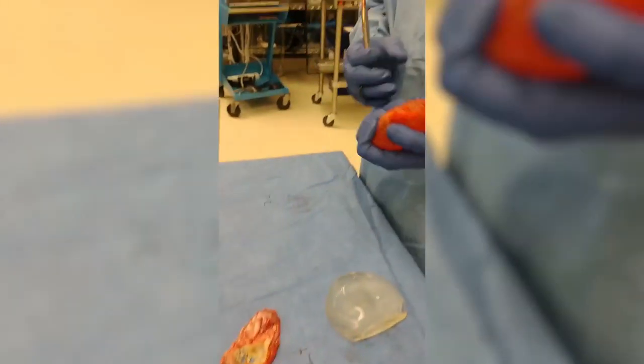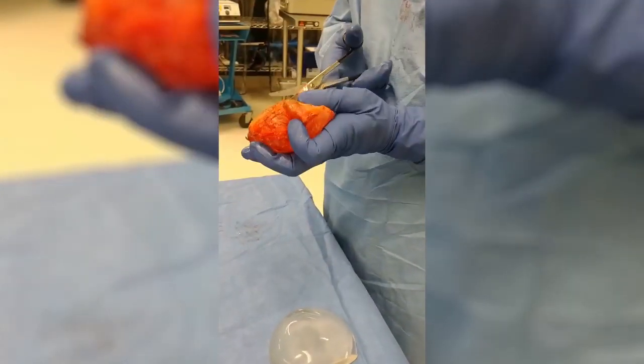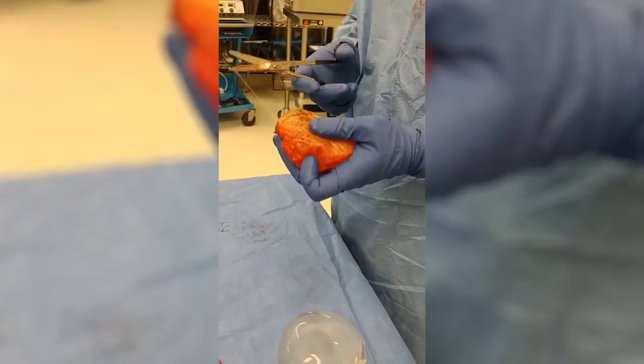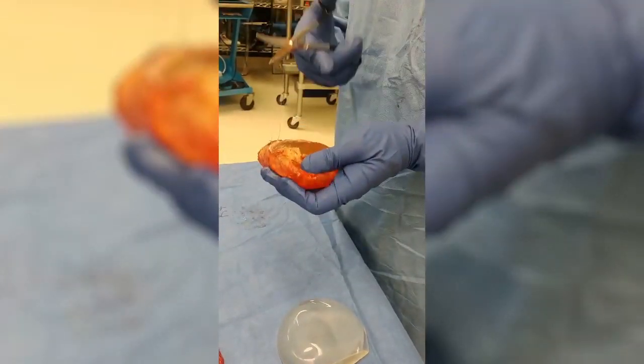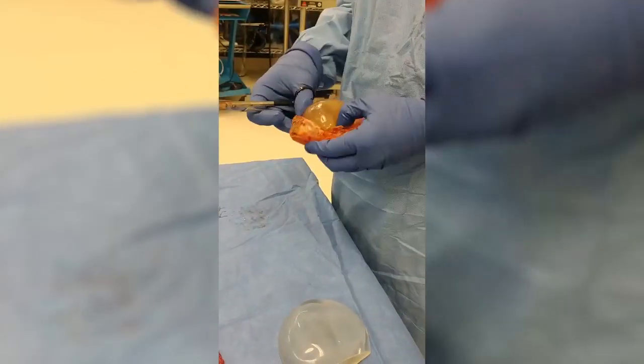On this side, we've got our capsulectomy with our implant in place. We're going to remove this one. Already I can tell just by the stickiness that this one looks like it's ruptured. So clearly there's something going on here in terms of a rupture.